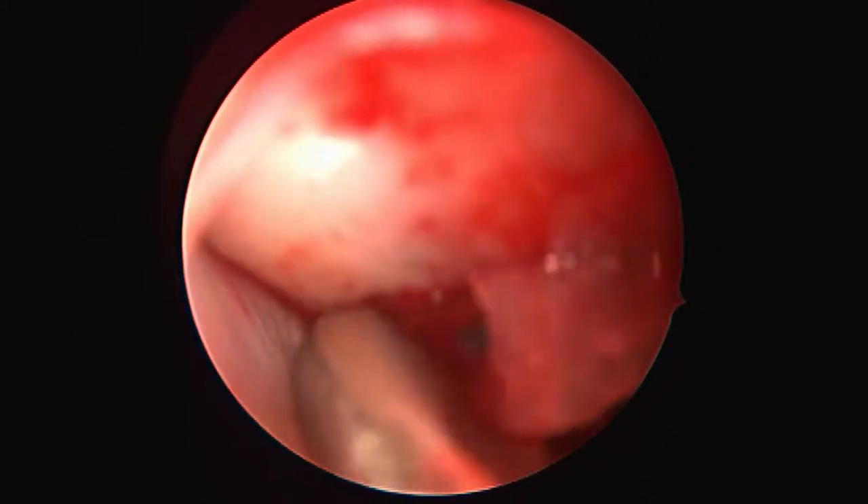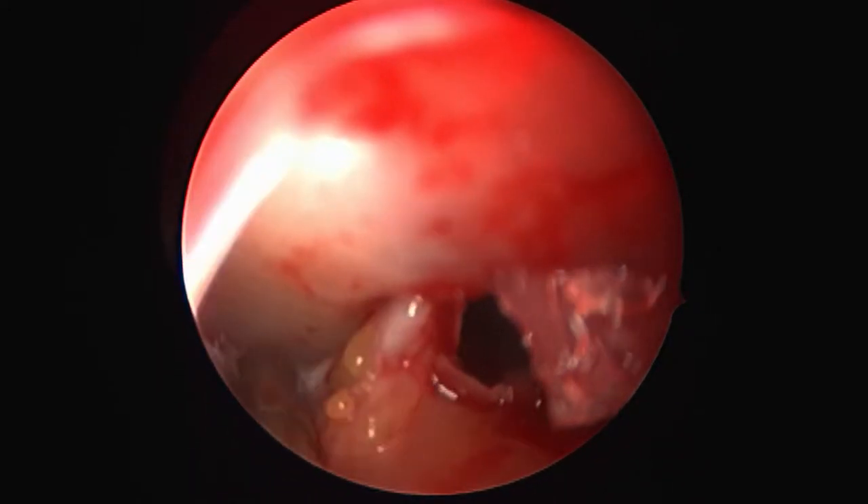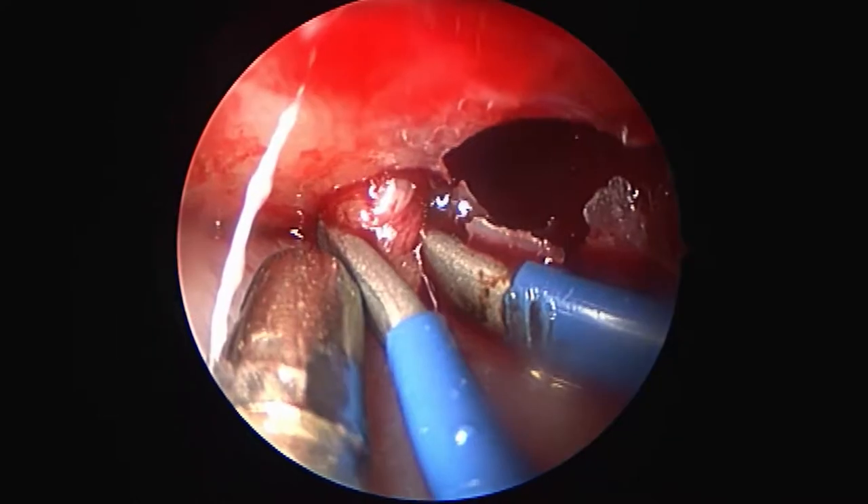As we follow it posteriorly, the lamina papyracea becomes thinner and very fragile, as demonstrated by this small fracture.